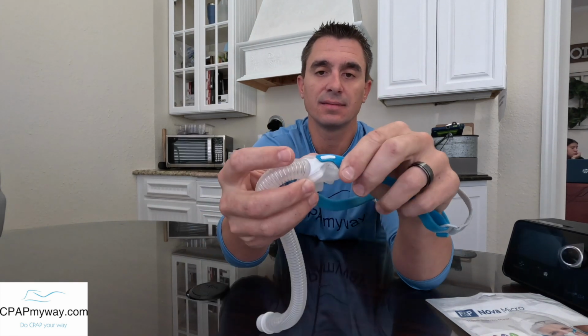And then I think you're probably going to have picked up on it already, but a couple of the drawbacks are going to be, I think the headgear may be something you replace a little more often than some of the higher end headgear. It's not a super expensive headgear, so I don't think that's going to be a big issue because it is simple. It fits really, really well. So I think the simplicity and the design of it supersedes the potential for having to change it out a little bit more often. This headgear attachment, I'm going to say, could be a potential issue for people with dexterity issues. You know, I obviously have no issue with it at all.